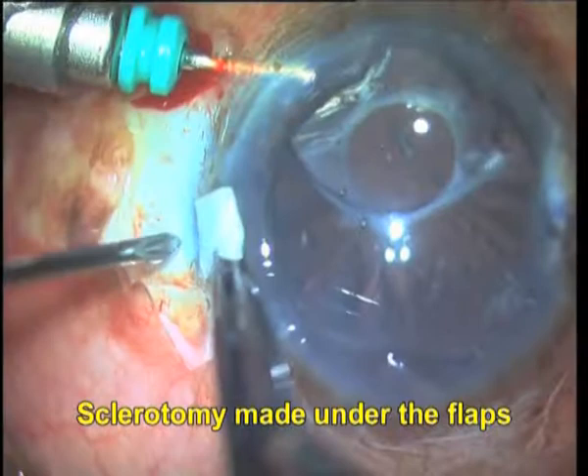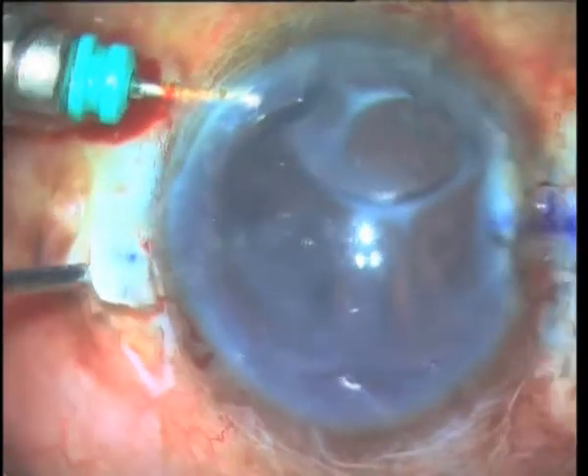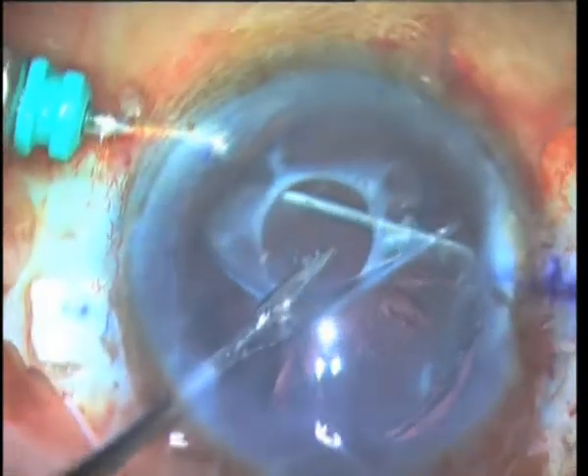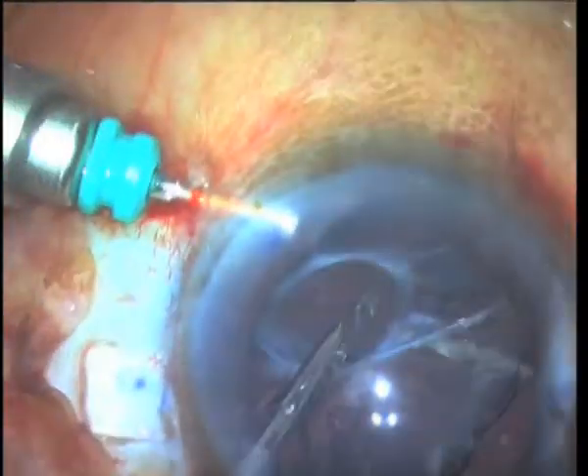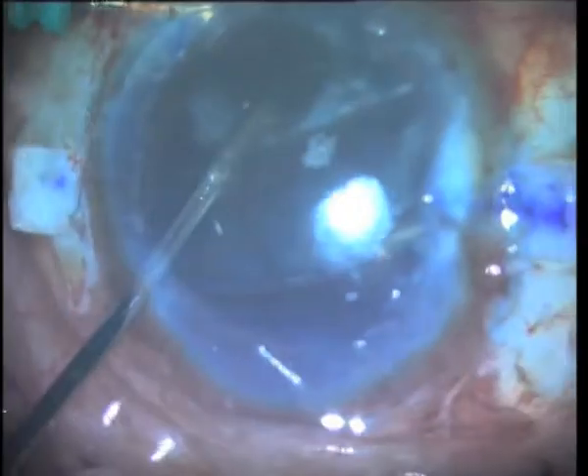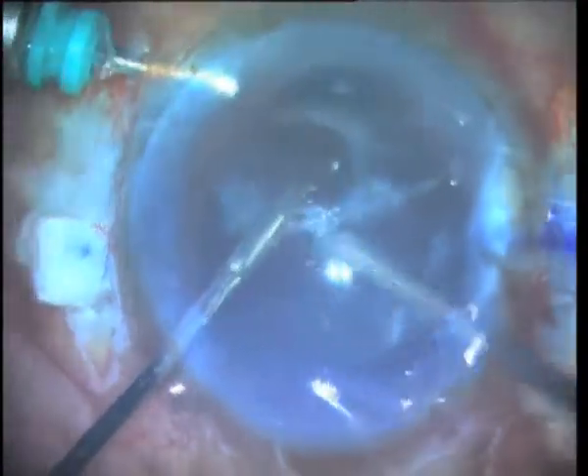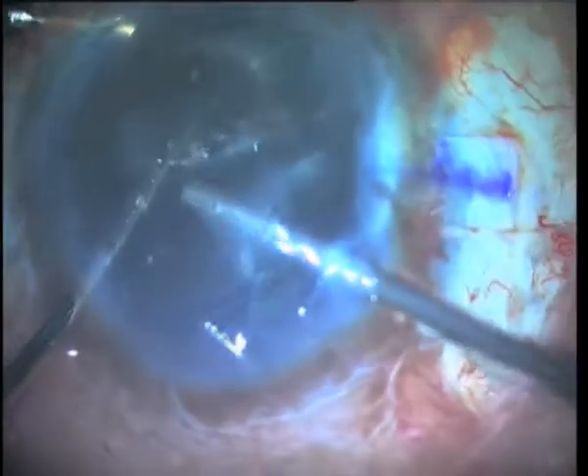Unable to free the complex, we proceed with making 22 gauge sclerotomies under the scleral flaps. Anterior vitrectomy is done, and once freed of its adhesions with the aid of the vitrector, the endocapsular ring is removed in toto.